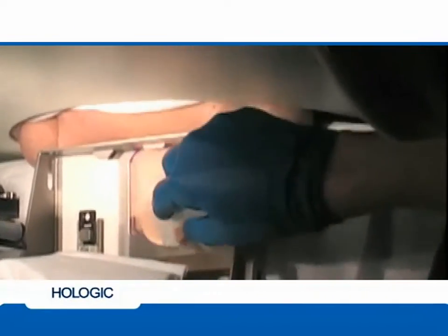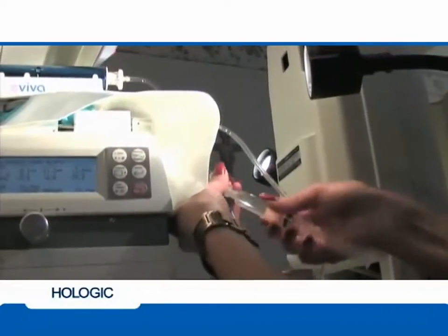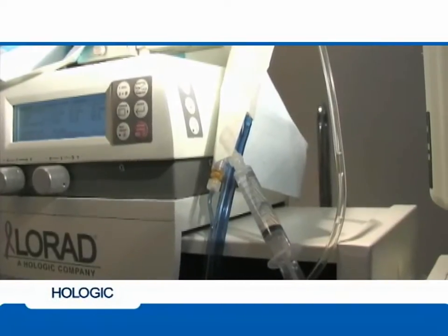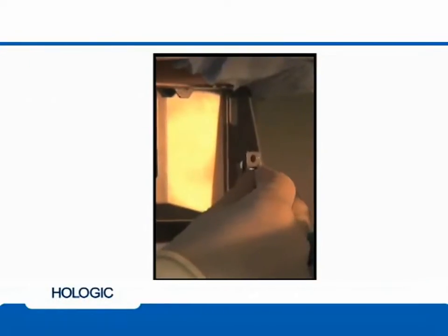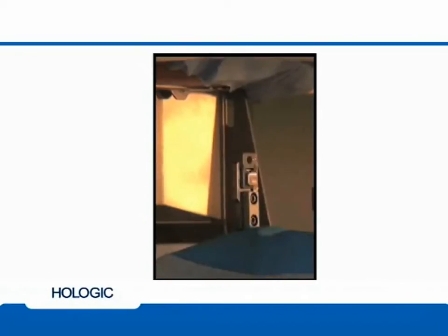Cleanse the skin surface thoroughly with an antiseptic solution. At this time, a syringe containing additional anesthetic can be attached to the Y valve. This permits additional anesthetic to be pulled into the biopsy cavity during each cutting cycle. The disposable needle guide is placed in the needle guide holder on the adapter using aseptic technique.